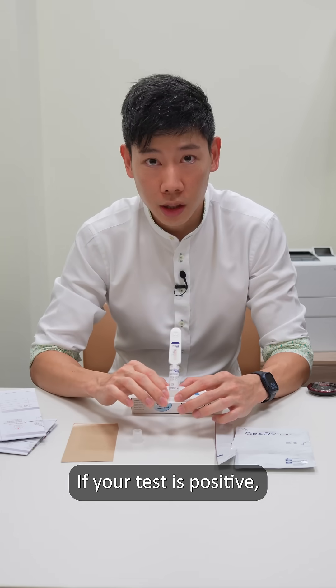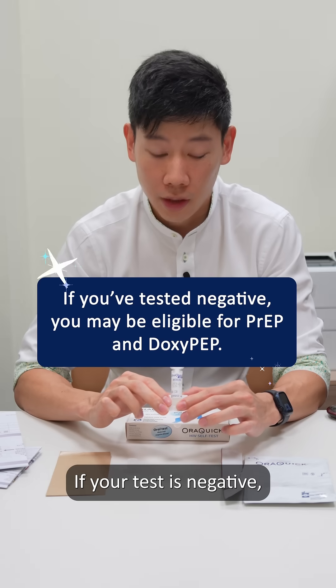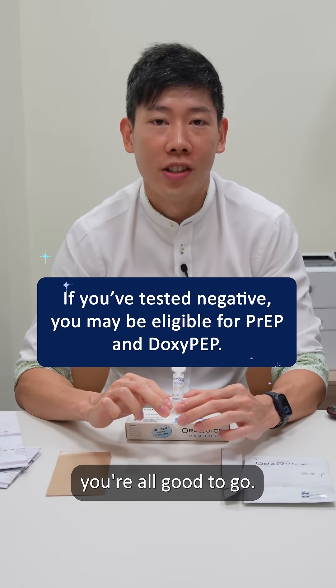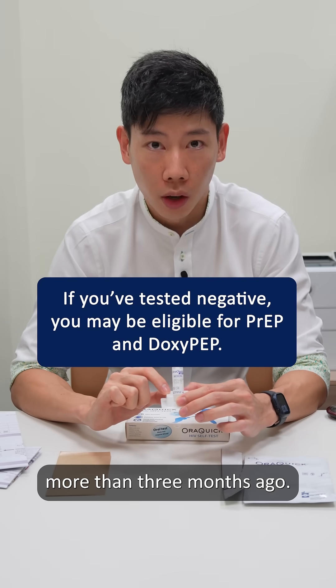If your test is positive, don't panic — please make an appointment with your doctor. If your test is negative, you're all good to go. Note that this test is only accurate for events more than three months ago.